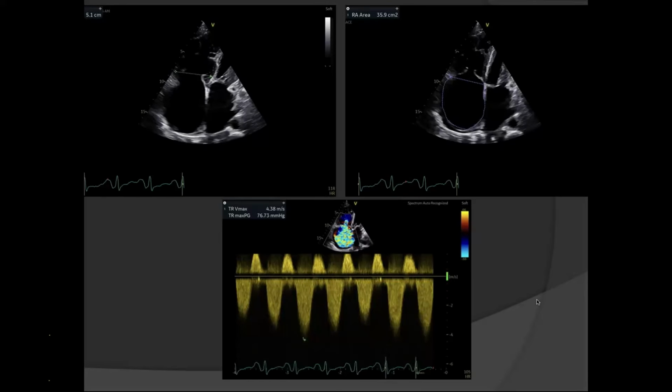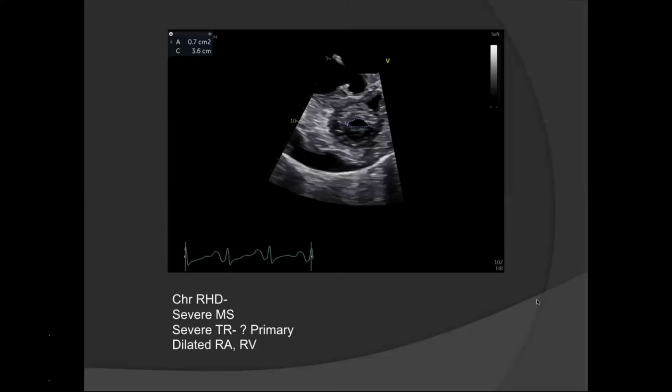We had this patient imaged today itself. Mitral stenosis, planimetered. We have more images, but in the interest of time, I just focused here. Area calculated was 0.7 centimeter square. Planimetered area, both commissures fused, clearly fish mouth appearance, severe mitral stenosis. So here, an interesting scenario.